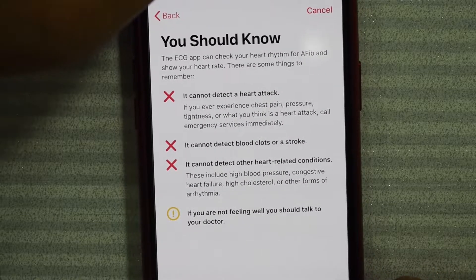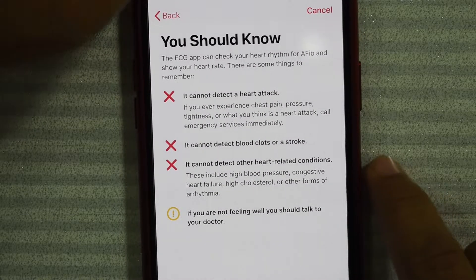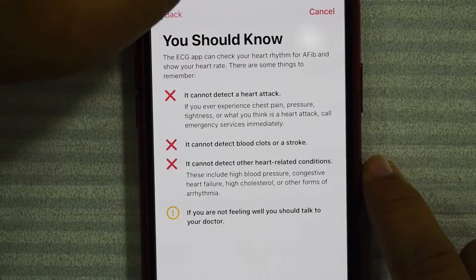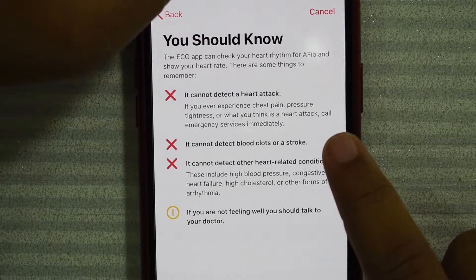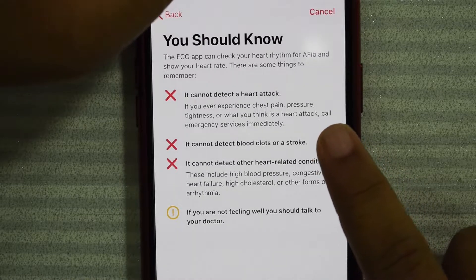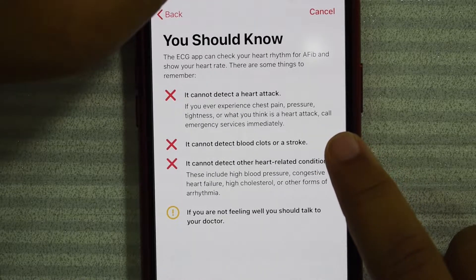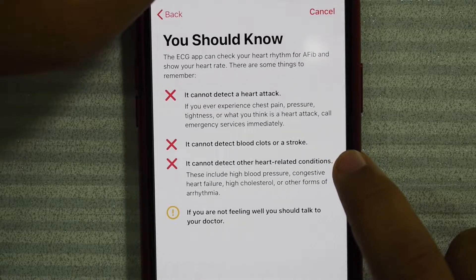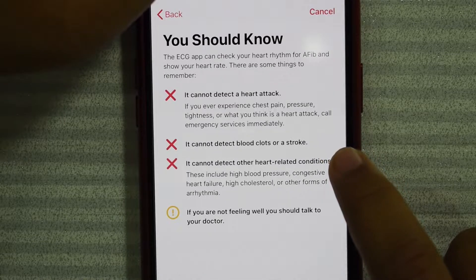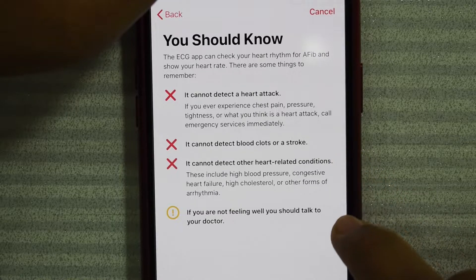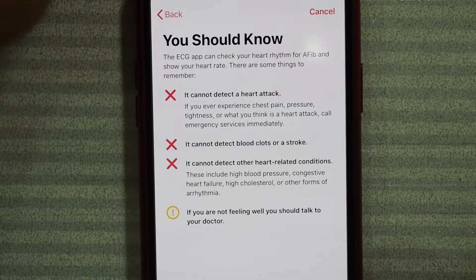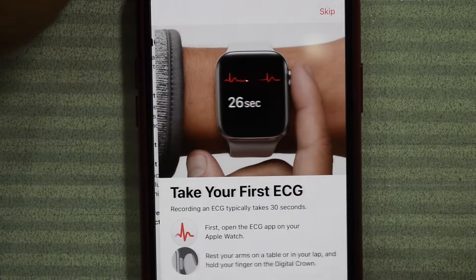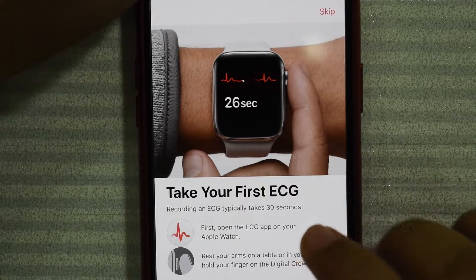You should know the ECG app can check your heart rhythm for AFib and show your heart rate, but there are some things to remember. It cannot detect a heart attack, it cannot detect blood clots or stroke, and it cannot detect other heart-related conditions. If you're not feeling well, you should talk to your doctor.